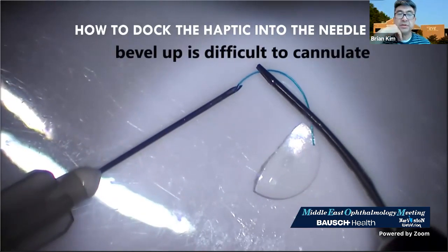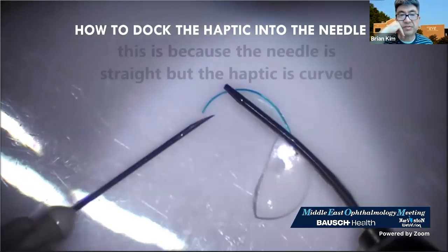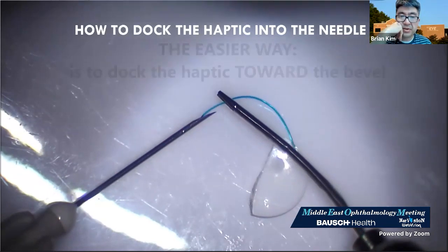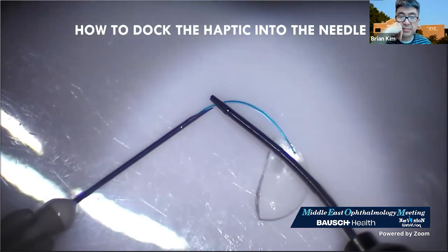So here the bevel is up, it's not working. Bevel is towards you, it's not working. Bevel down, but then bevel towards the haptic here. You can dock the haptic towards the bevel, flatten it out, straighten it out, and then you could advance the haptic in the needle.